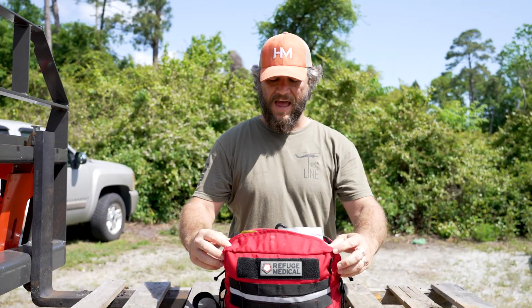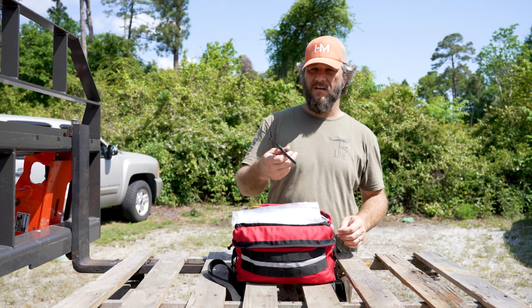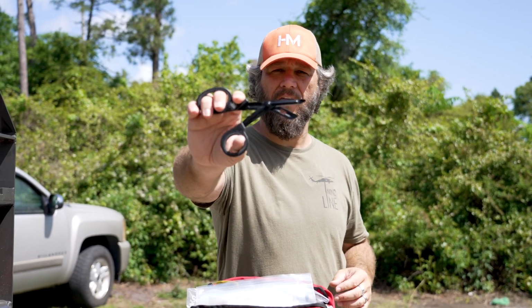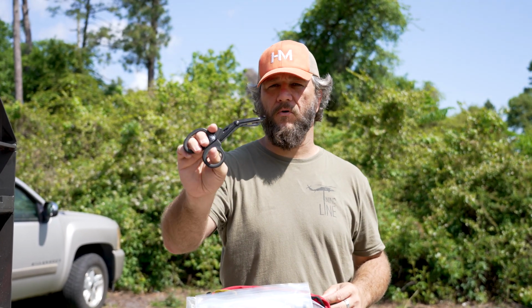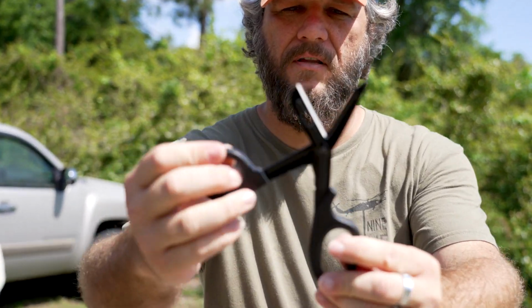Let's just go through the bag and see what's in here. The first thing, trauma shears. Let me just say this real quick too. I'm not qualified to teach how to use any of this stuff, okay? I'm just a regular guy. I've taken some courses on how to use a lot of this stuff, but I'm certainly not in any way capable of showing you how to use any of this. I'm just going to show you what's in the bag and why it's good to have this stuff. Anyway, trauma shears. These are really good ones. These are from North American Rescue. They have an oxygen tank wrench built into them.